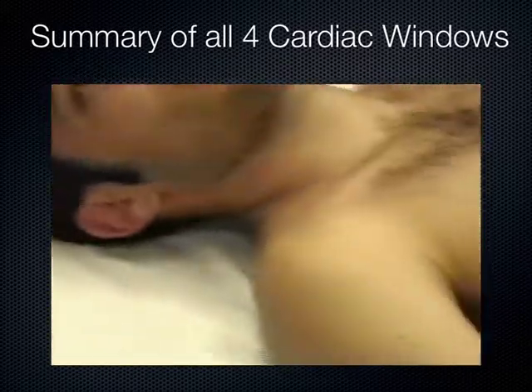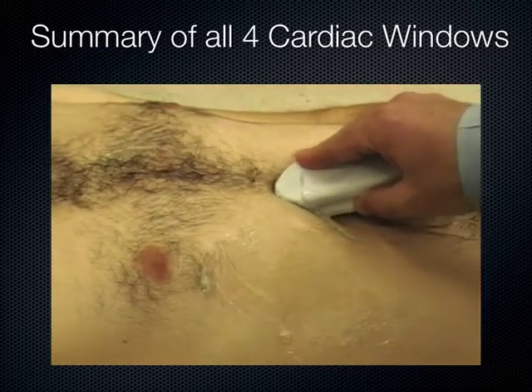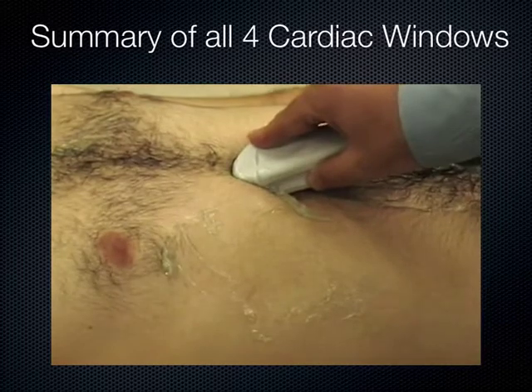Again, if you look at the probe here, the indicator is towards his right. I just looked at the liver, and I saw the liver, and then I saw the heart. That's the way you do it. You start at the liver, you slide up into that fossa till you see the heart.